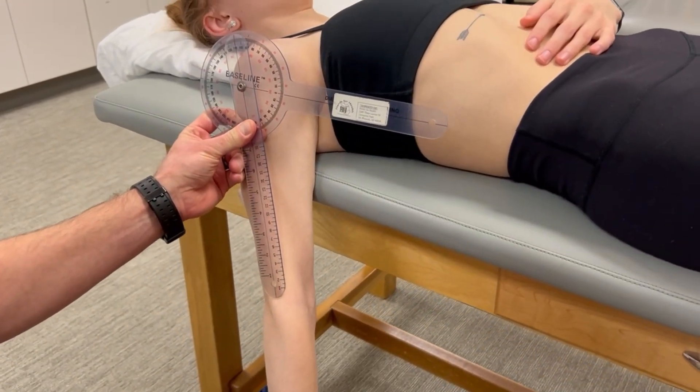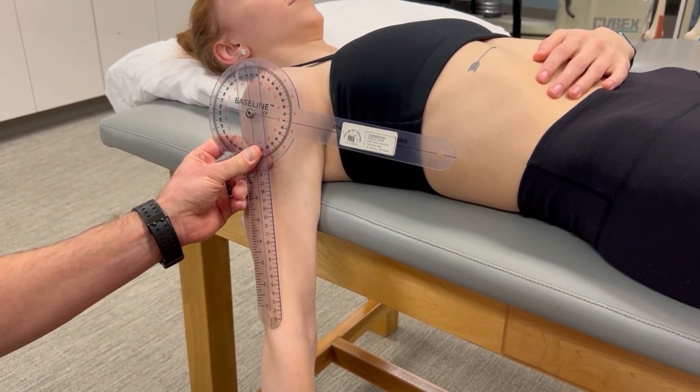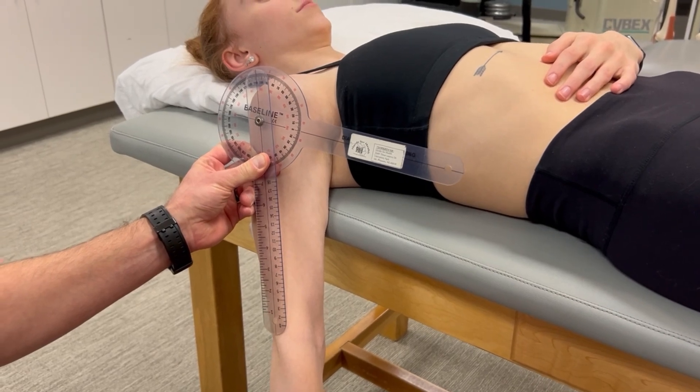Our reference arm is parallel with the lateral midline of the trunk, and our indicator arm is parallel with the humerus or the arm.